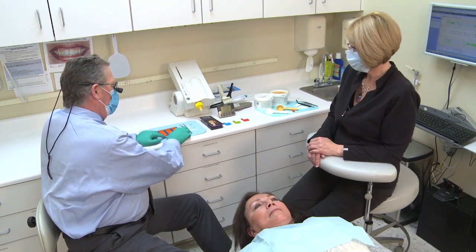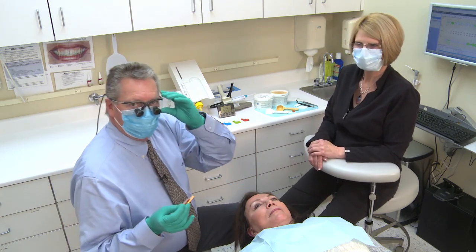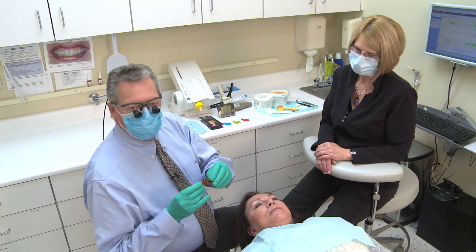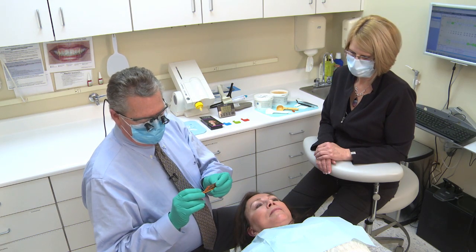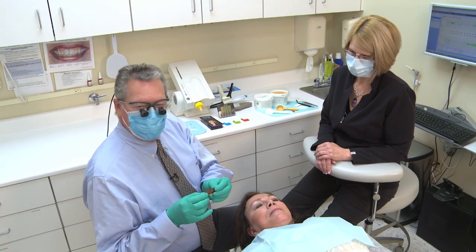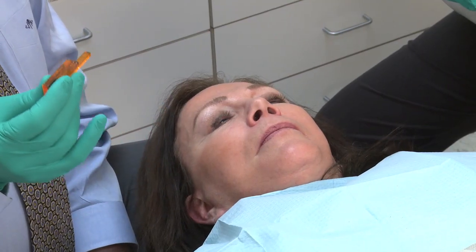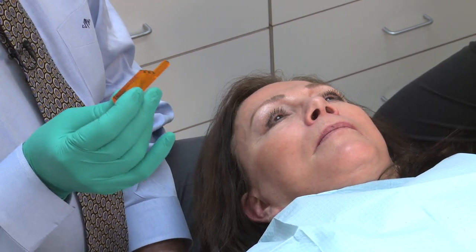The first thing we want to do is determine if there is a vertical component to the bite. This is the Airway Metrics Snore Screener. You have different vertical components. The first step is 4 millimeters. The next step is 8 millimeters, and the last step is 12 millimeters. So let's start with 4 millimeters of vertical and see how that affects Kim's snore.